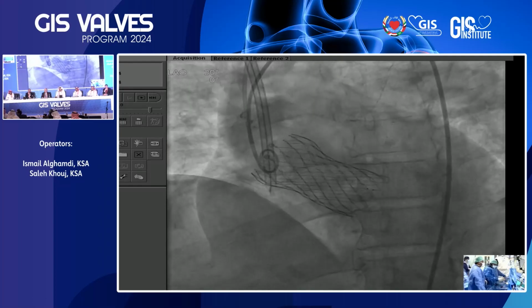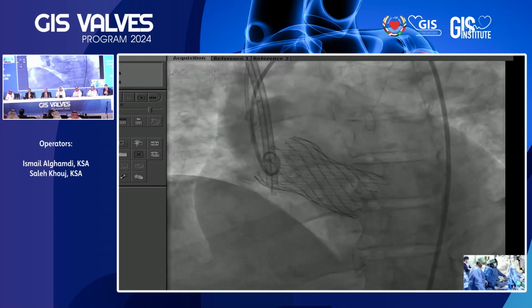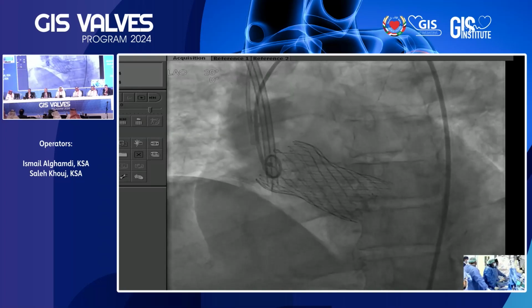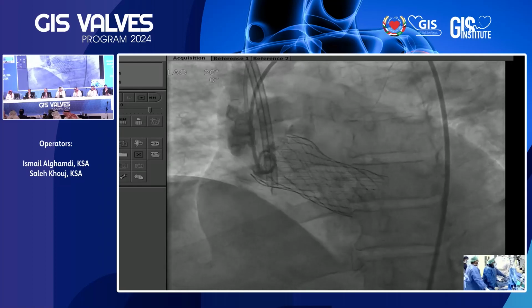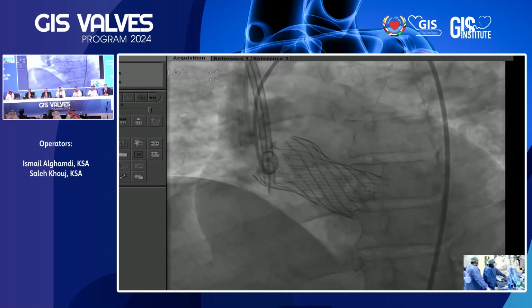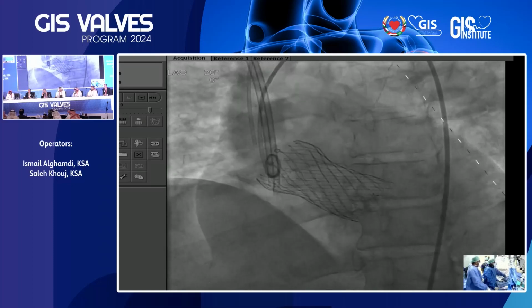Go ahead. In terms of height, this is acceptable in all honesty for a bicuspid anatomy. The only price you pay is if you have to go for a post-dilatation. This is not uncommon with bicuspids, but we know we want to implant them high. So we really have to balance between the chances of ending up at a zero level and having to do a post-dil, which obviously becomes a bit dangerous.